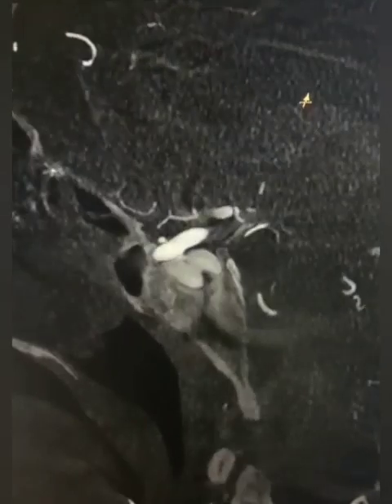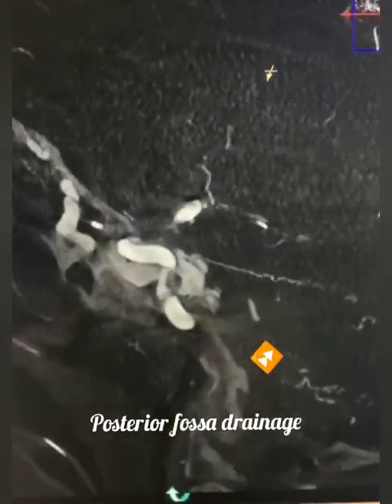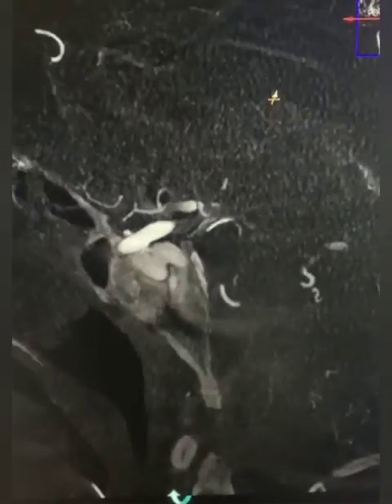Through the intercavernous sinus, it communicated with the opposite side, which in turn had an anterior drainage into the ophthalmic vein and posterior drainage into the cerebellar veins, causing cerebellar venous congestion.